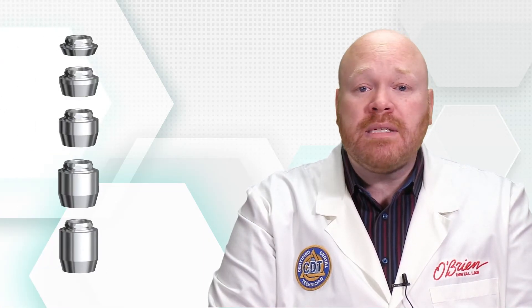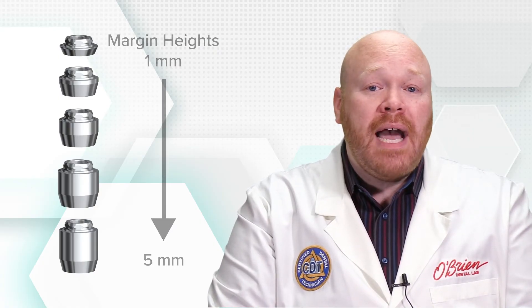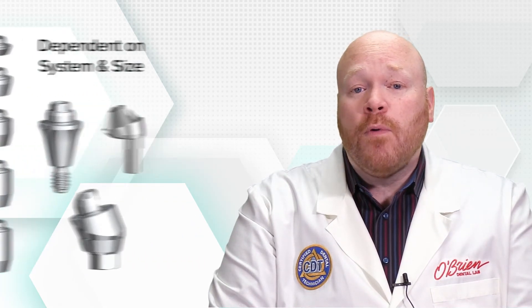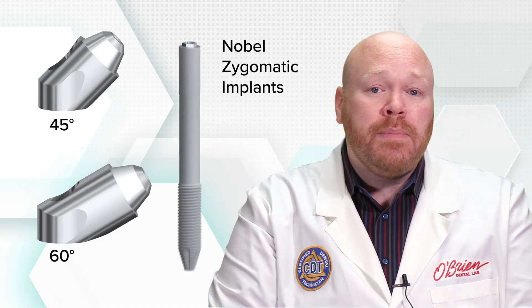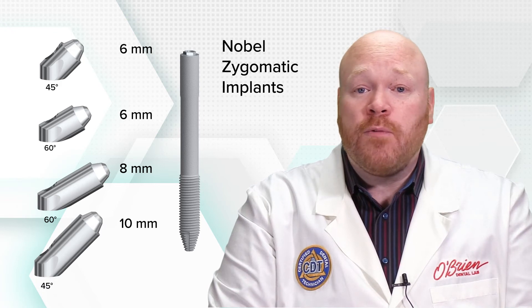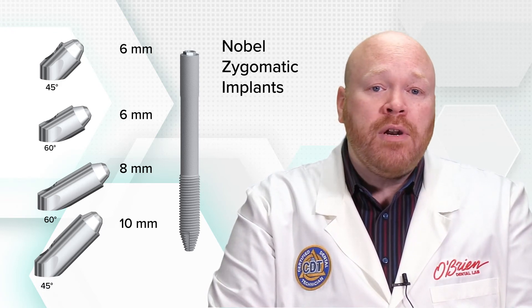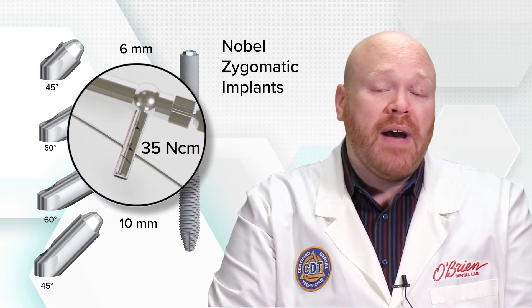Both the straight and angled abutments come in various margin heights between one and five millimeters; the exact heights available are dependent on the system and size. There are also 45 and 60 degree abutments for use on the Nobel zygomatic implants, which are available in extended margin heights of six and eight millimeters, and up to 10 millimeters for the 45 degree abutment. Unlike the other angled multi-unit abutments, the 45 and 60 degree abutments get torqued to 35 newton centimeters.